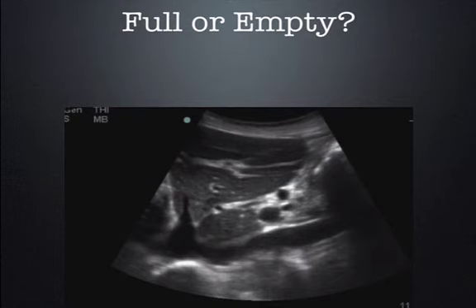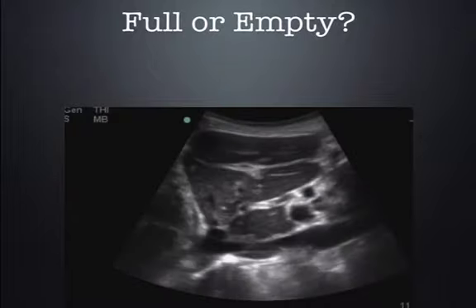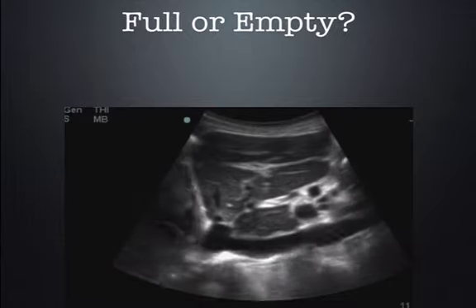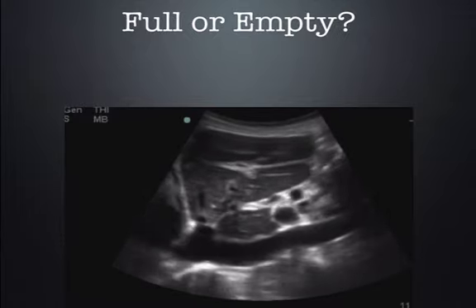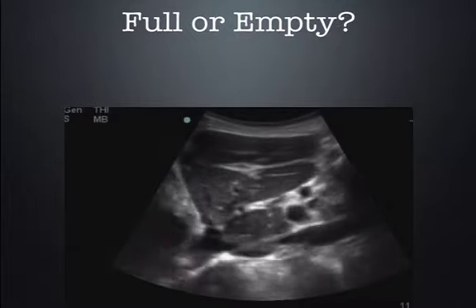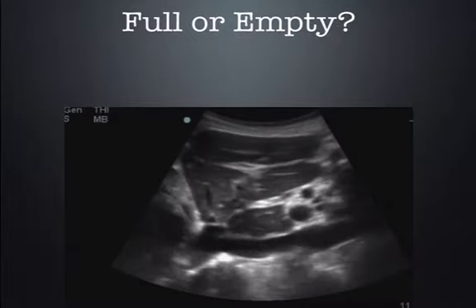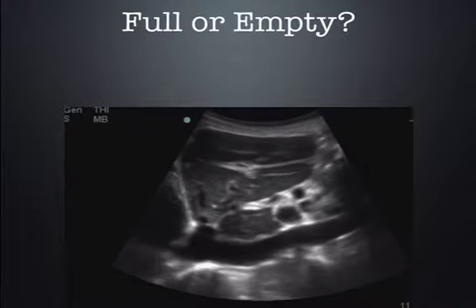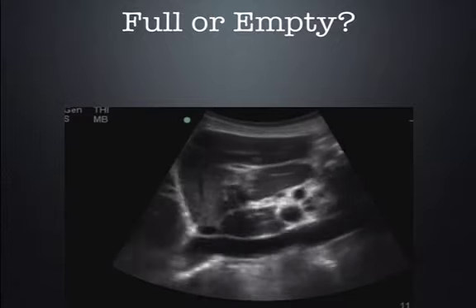So what do we do with the in-betweeners? The subjects whose IVC is not fully collapsible, the subjects whose IVC is not plethoric and resistant to collapse with respiration. What do we do with this subject right here? In this case, just looking at it, doing kind of a qualitative analysis, which is all you really need to do, I'm not an advocate of measuring the IVC and getting exact numbers. Just look at it and say it's approximately a 50% collapse with inspiration. What do we do with this IVC here?